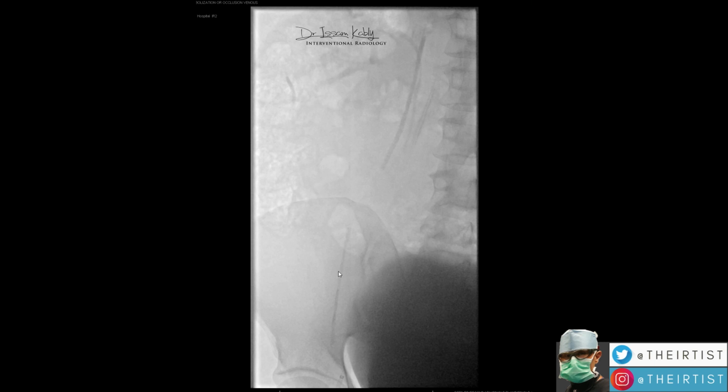And this is again, in my opinion, the superiority of this technique. Not only is it less invasive than surgery, it does not involve any stitches or opening or scar or general anesthesia. It does not have the risk of injuring the arteries of the testicle or the lymphatic vessel, and also it allows us to see everything and occlude it immediately.